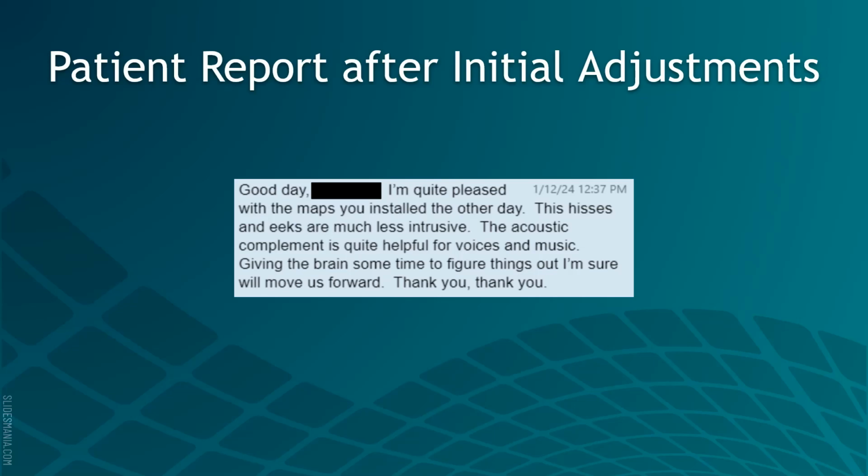I mean, the patient sort of has our mentality, so that made the counseling relatively easy once we got him the results we were after. But again, this was still a situation where speech and noise still needed some more work. We're moving in the right direction, but there's still a couple of small adjustments that can be made.